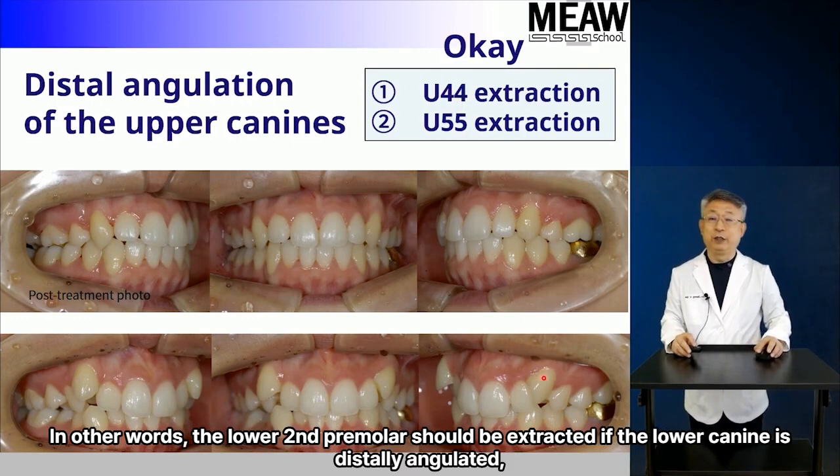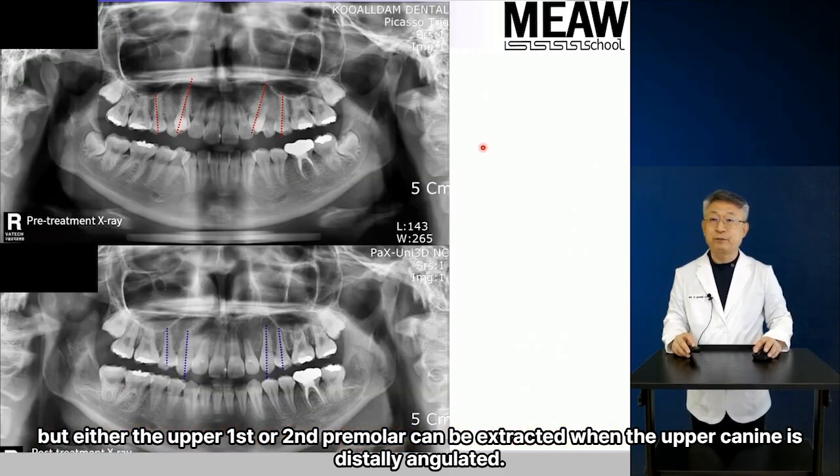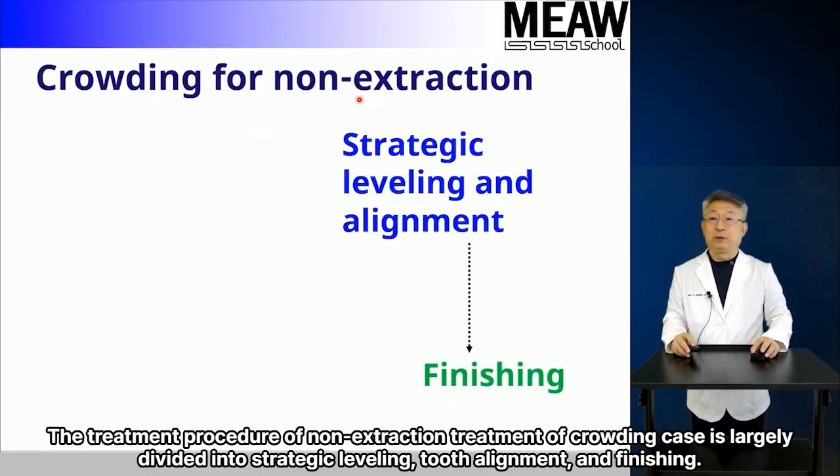In other words, the lower second premolar should be extracted if the lower canine is distally angulated, but either the upper first or second premolar can be extracted when the upper canine is distally angulated. In this patient, the upper first premolars were extracted and proper upper canine angulation was achieved. The treatment procedure of non-extraction treatment of crowding case is largely divided into strategic leveling, tooth alignment, and finishing.